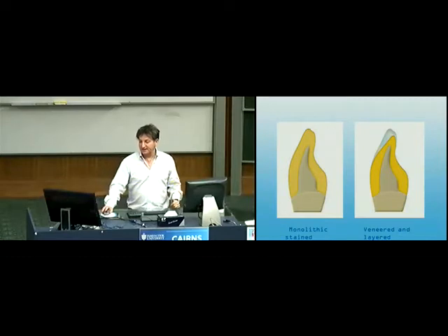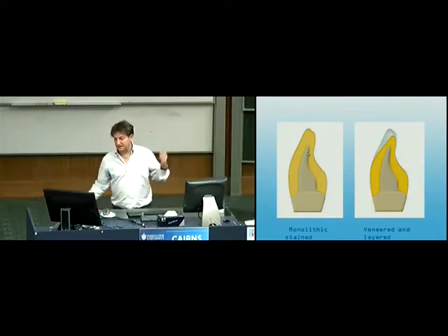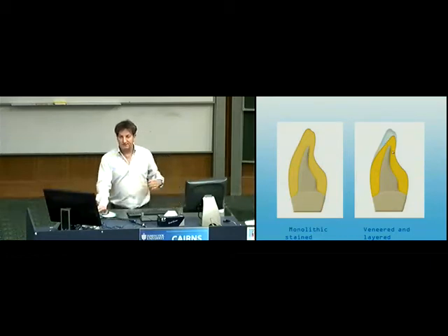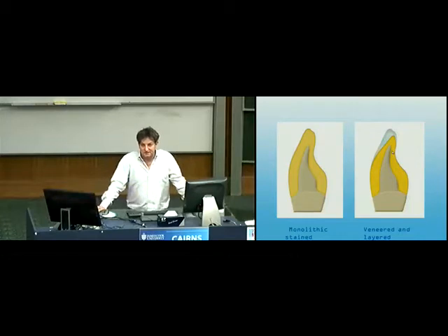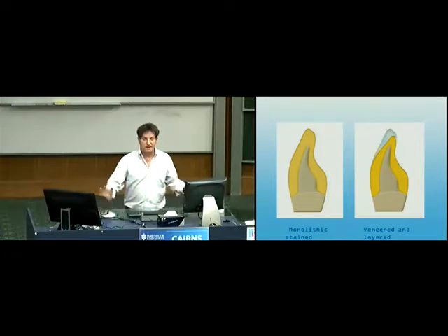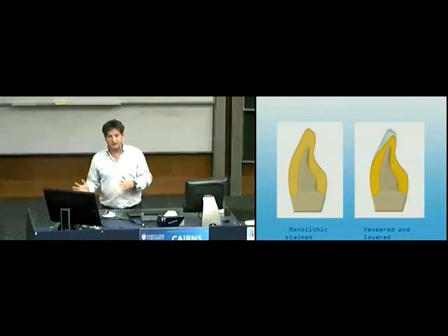In a situation over here, you've got one chunk, monolithic, of course, just one piece. And then over here, you've got a piece which we started off as being monolithic, but we've cut it back and added a veneering ceramic over the top. Now, every time you get a join between materials, potentially you can get a weakness. Remember that. The more layers, the more joins, more things that can go wrong.